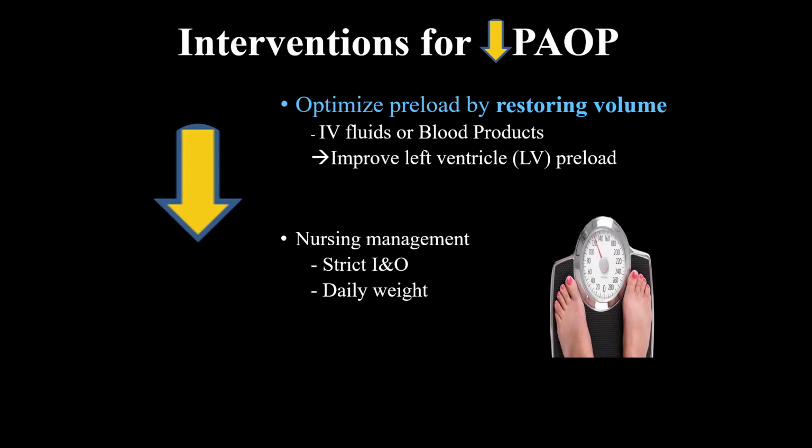He's 92, and I think he weighed 90 some pounds soaking wet. And I was so fearful of giving him fluids because I thought I'd throw him into failure at that point. So it's important to pay attention, take a look at their echoes, make sure that their ejection fraction can handle this. And remember, we're probably getting the NICOM parameters to see if they're going to be volume responsive if we didn't have a Swan in, and we suspect their wedge is low. It's only if I have a Swan in that I ever get a wedge. Okay, but we can make those judgments with that NICOM non-invasively by guessing that the preload is low.